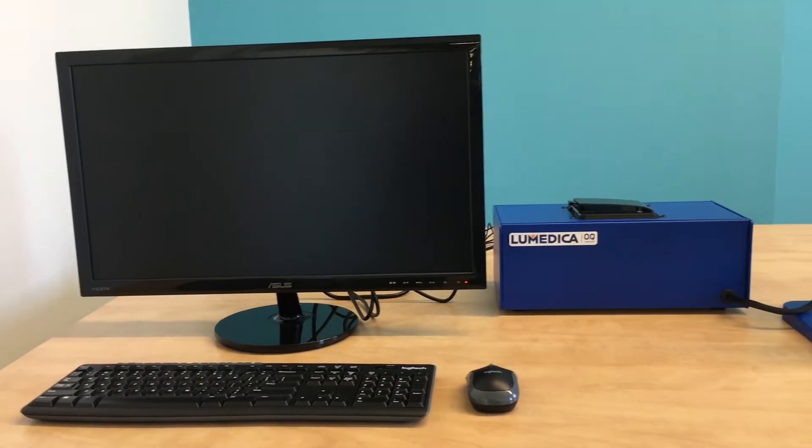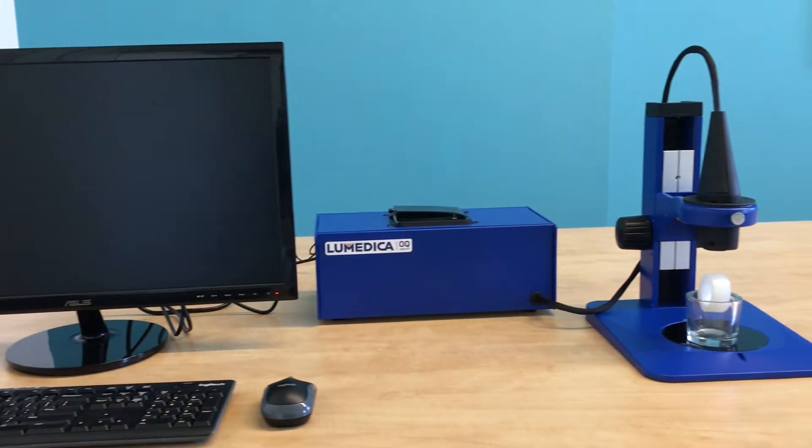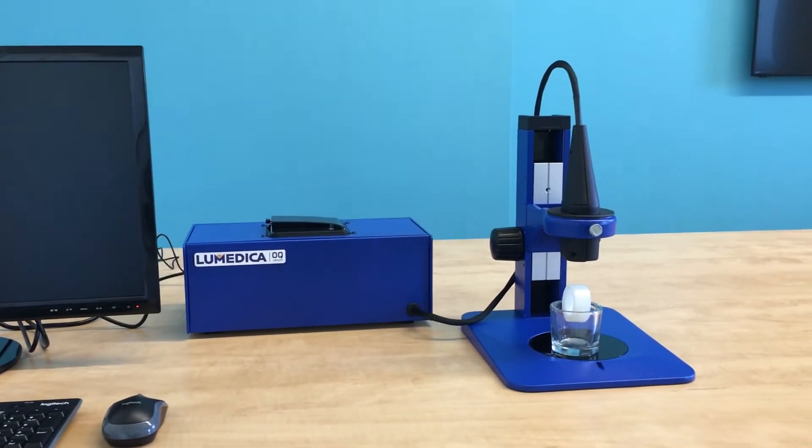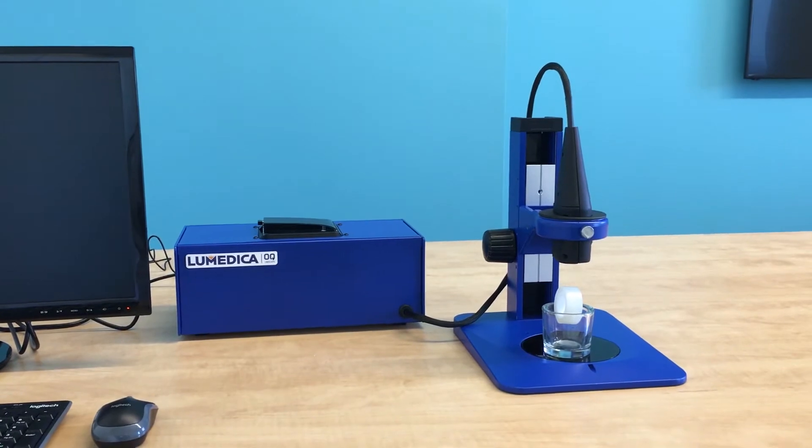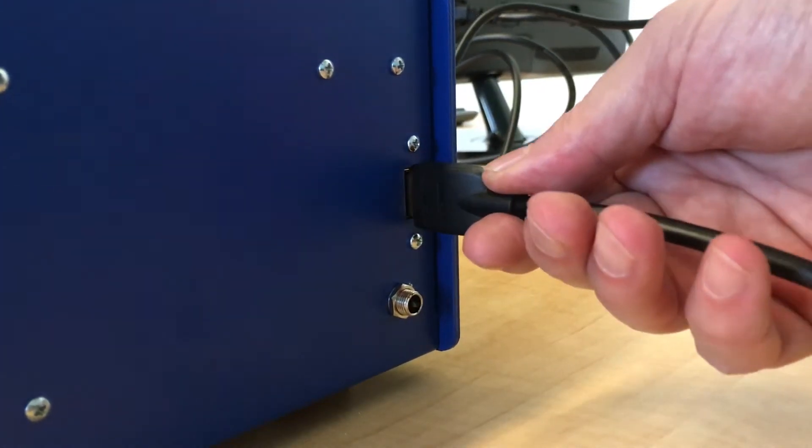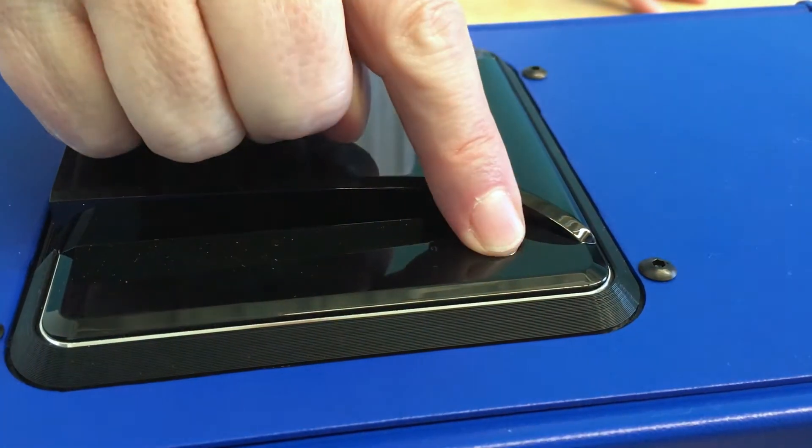The OQ Labscope ships complete for under $10,000. To be clear, that's a whole OCT system. You get the optical engine and an integrated Windows bootable computer. Right out of the box, all you have to do is plug in a cable, push the button, and you boot it up just like a regular computer.